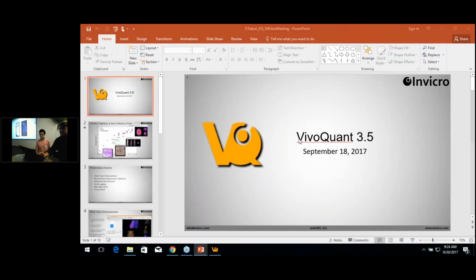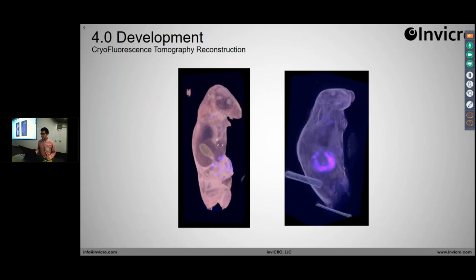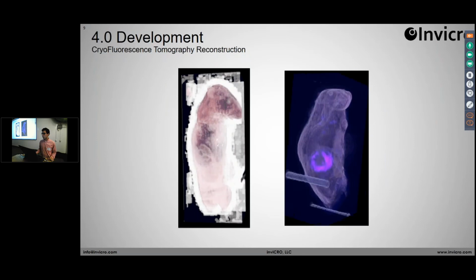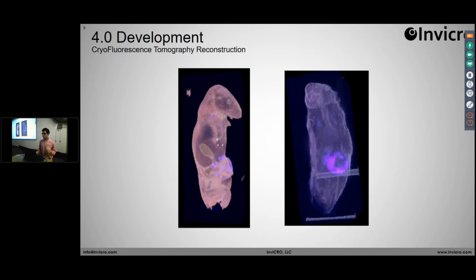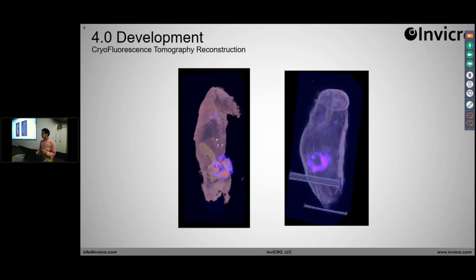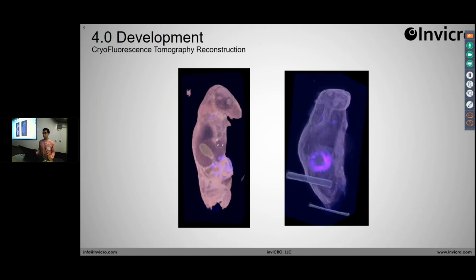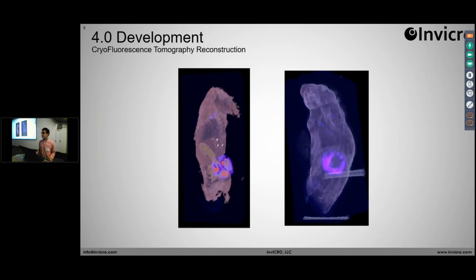There we go. In 4.0, there's a little bit more on this in a talk later today, but we've been doing a lot of development together with our image analysis team to create nice visualizations of cryofluorescence data.